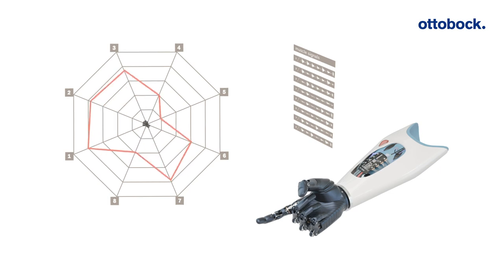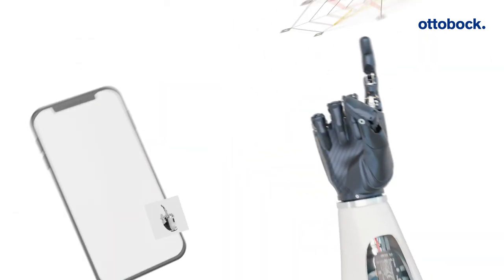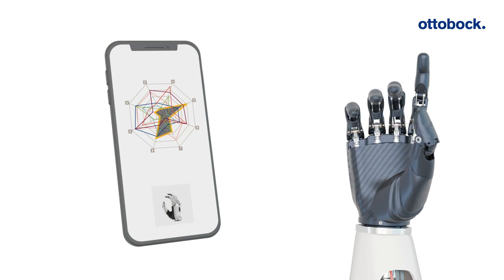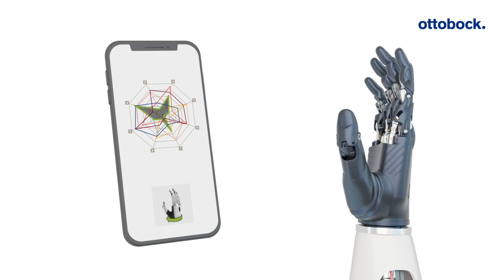The MyoPlus app is the central interface between the user and the control unit. It basically serves as a window into the prosthesis, visualizing the hidden movement patterns in the residual limb.